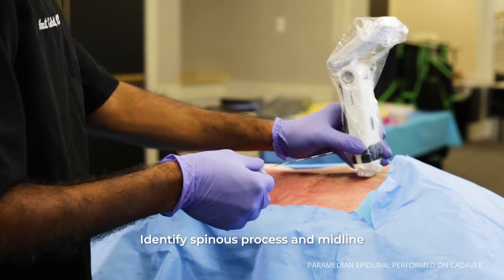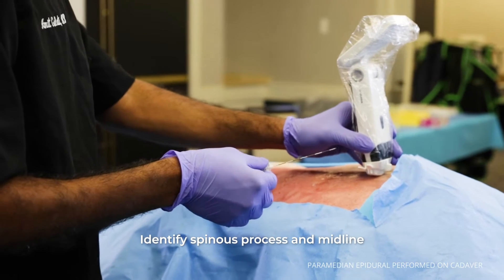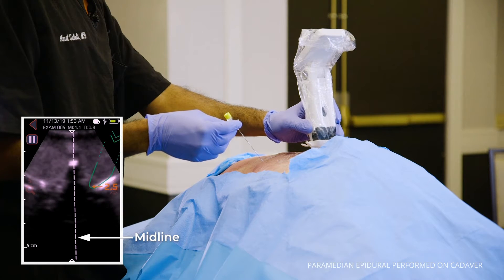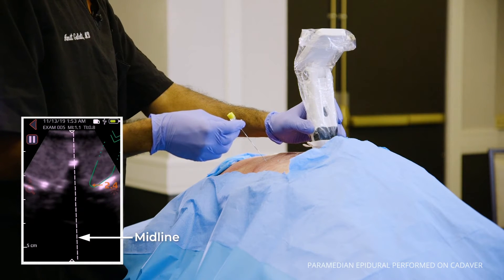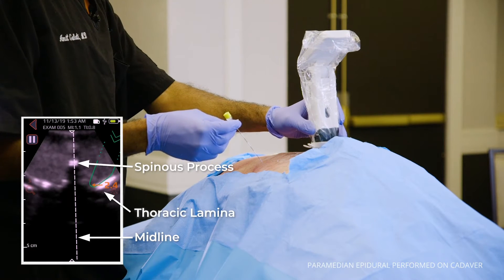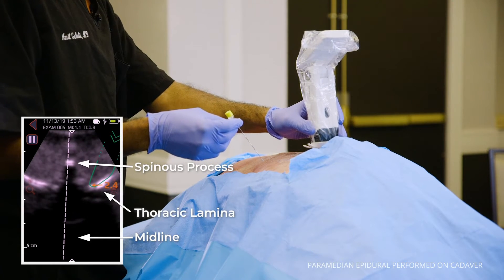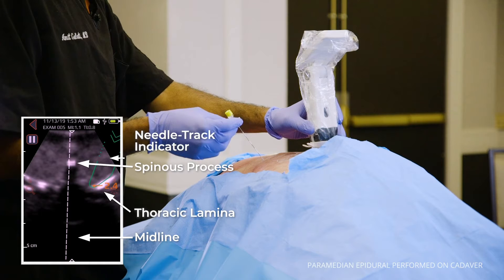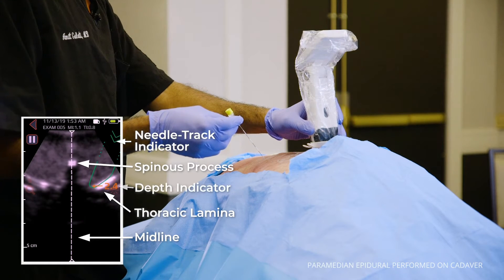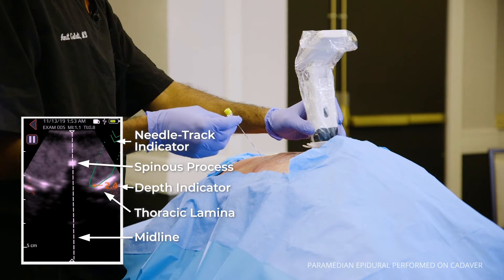Once you have the spinous processes in midline with the Acuro system, you will notice that once your Acuro device has identified both the spinous process and the thoracic lamina, it will give you guidance. We're using a green image for the needle tract indicator, and then it will give you a depth that is orange, telling you the depth of the lamina from the skin.